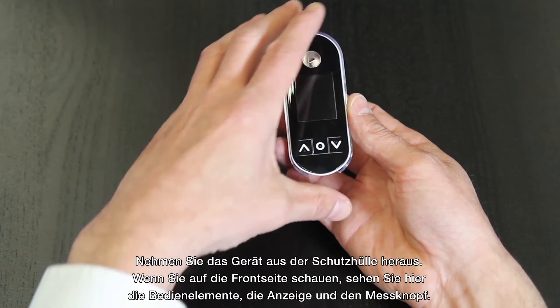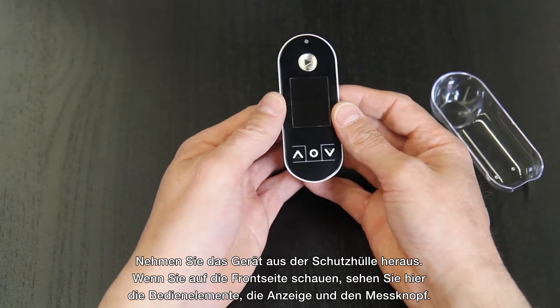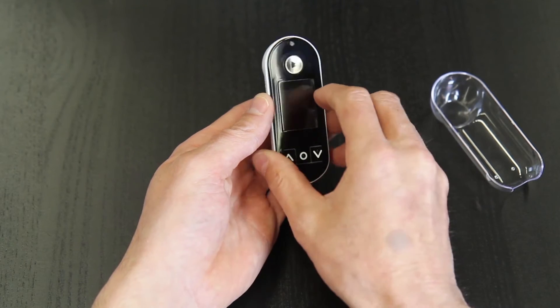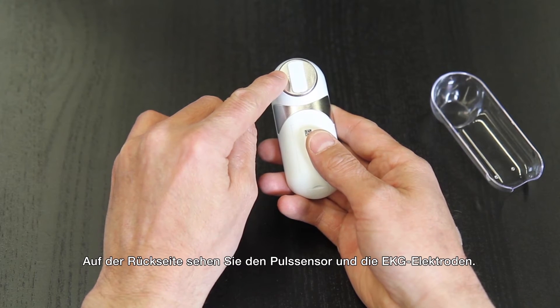Simply remove the protective cover from the device and you'll see the controls, the screen, and the measurement button. On the back, you'll see the pulse sensor and the ECG electrodes.